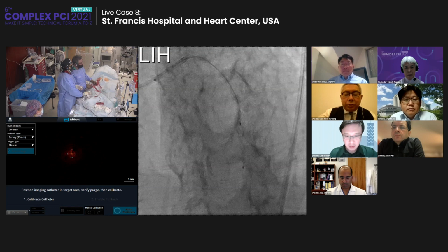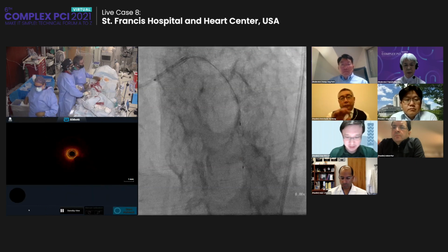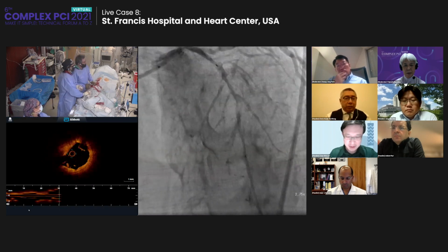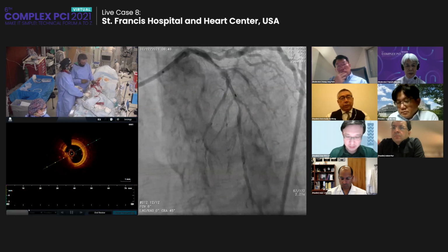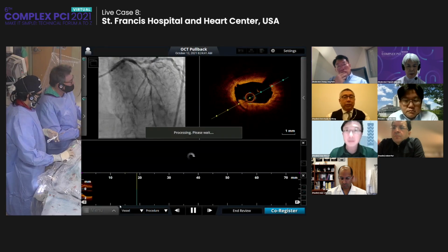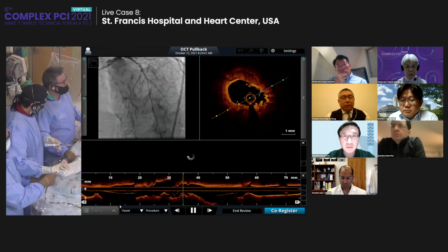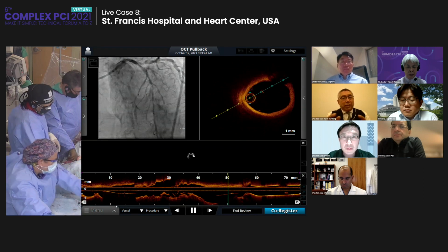Can I ask a question? Please. Chris Wong. After you have shocked those that have the calcified lesion, now the thickness of the stent that you're going to implant, does it make any difference in terms of the result? As we know that there are some stents with thickness of only 60 micron, while some of them may be up to 80, some 100 micron. So does the thickness of the stent make any difference in terms of the expansion of those calcified areas?